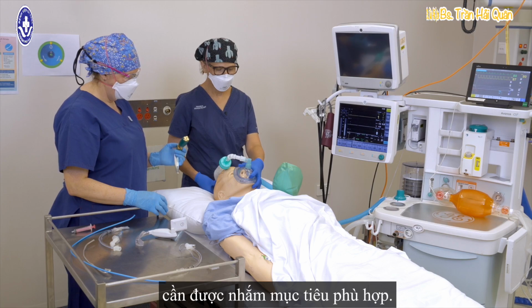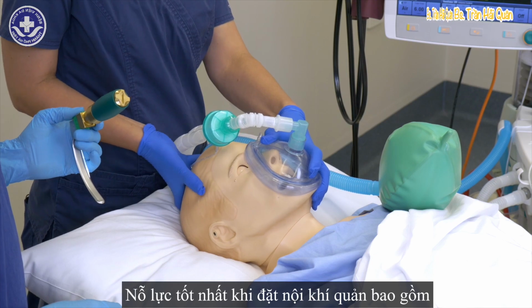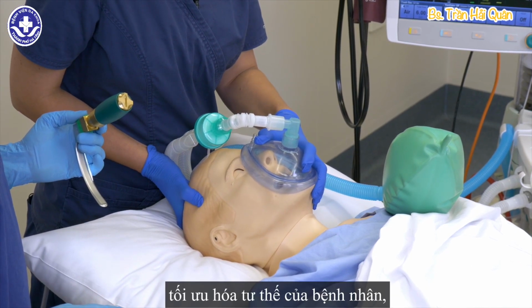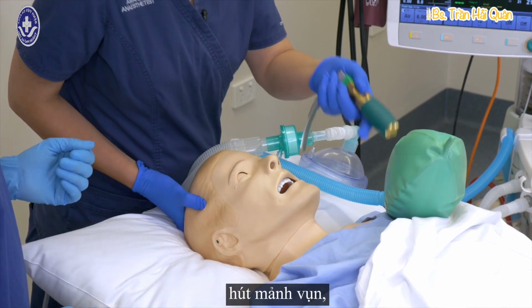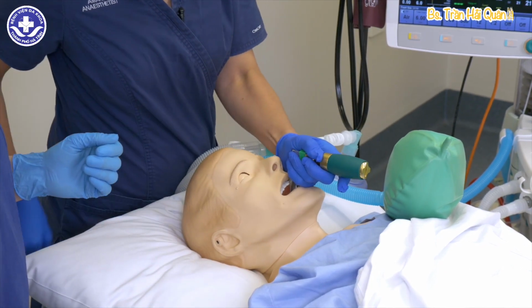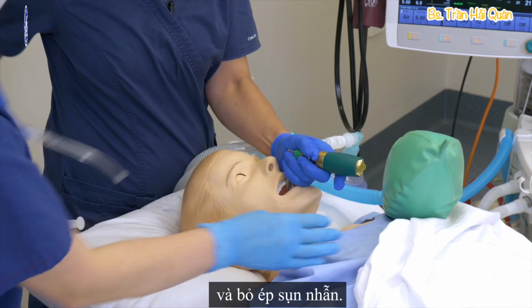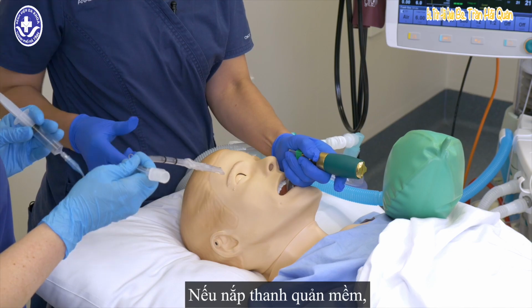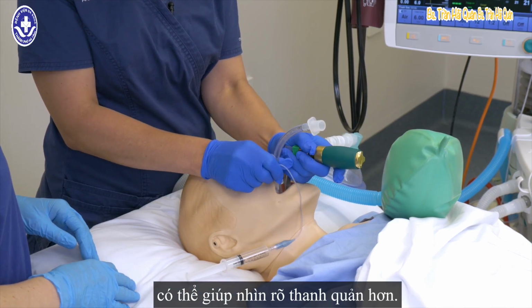be targeted accordingly. A best effort at intubation involves optimising the patient position, removal of dentures, suctioning debris, external laryngeal manipulation or burp, and removing cricoid pressure. If the epiglottis is floppy, lifting it up may enable better visualisation of the larynx.